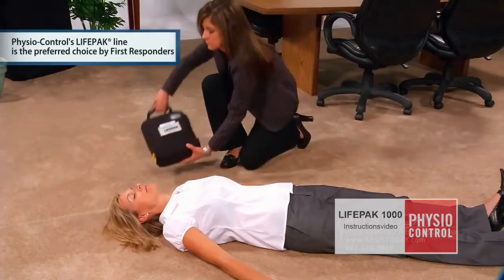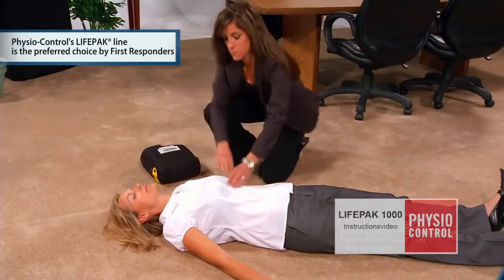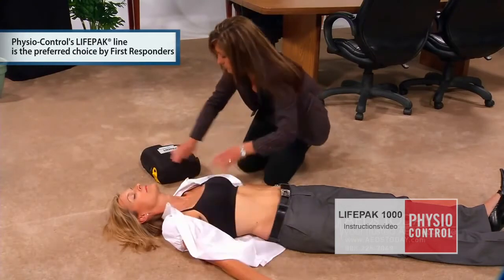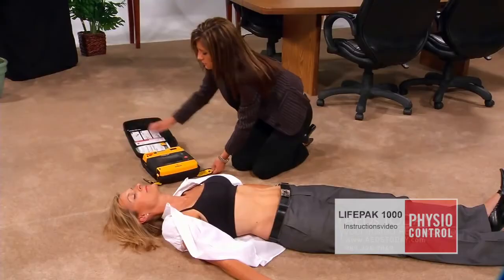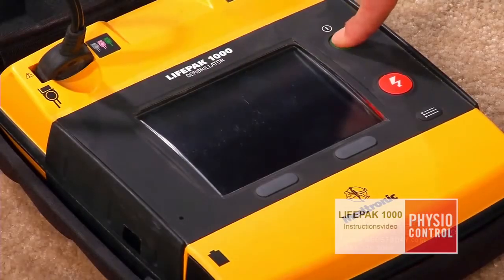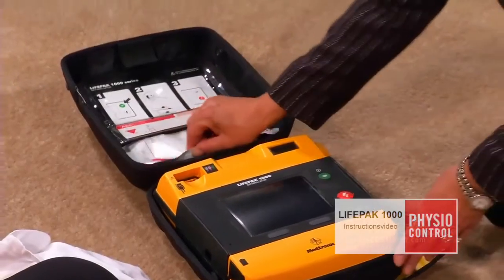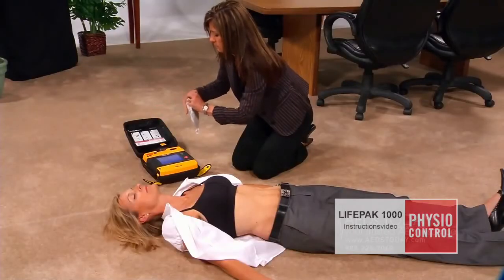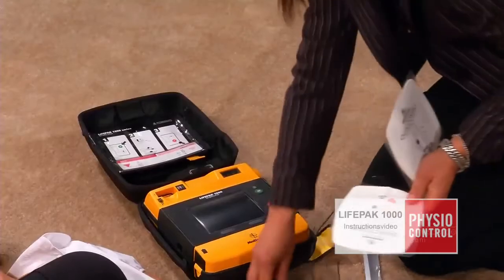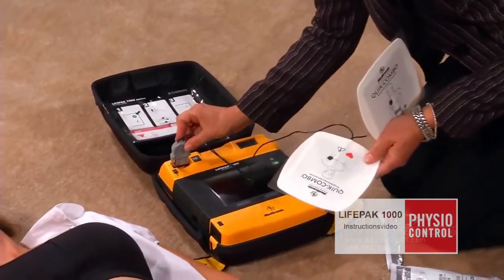Set the AED on the same side of the patient as you. Remove the clothing from the patient's chest as quickly as possible. Press the ON button. Connect electrodes by plugging them into the AED and then properly applying each electrode pad to the patient.